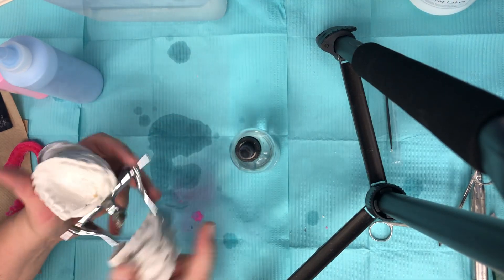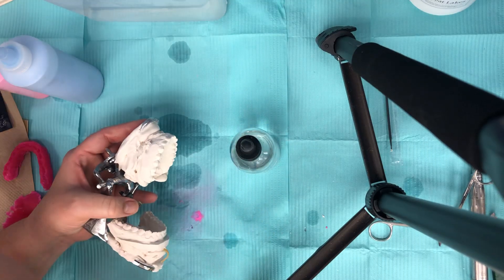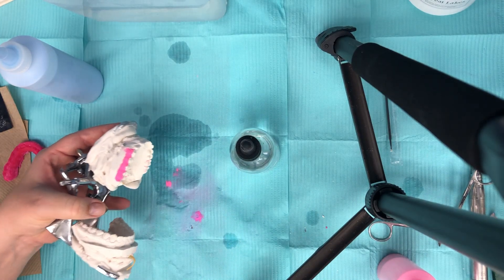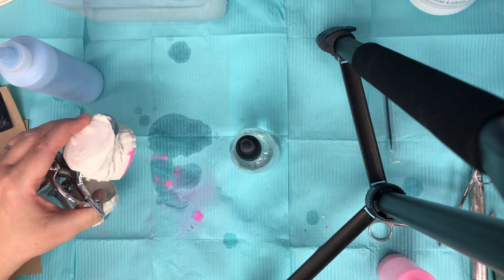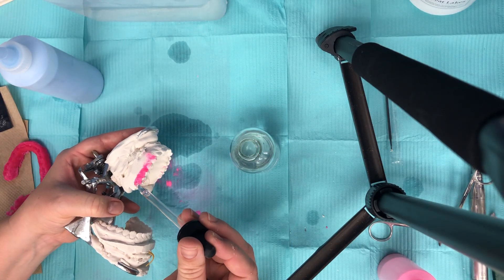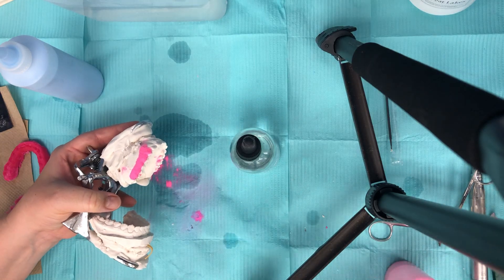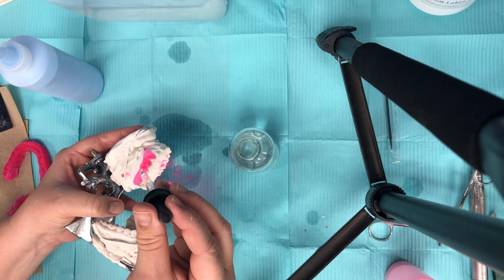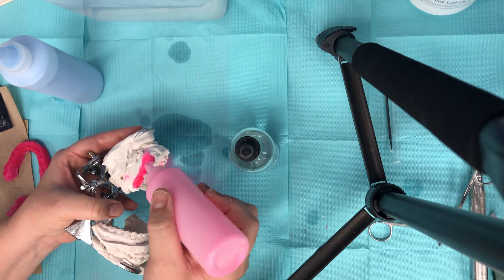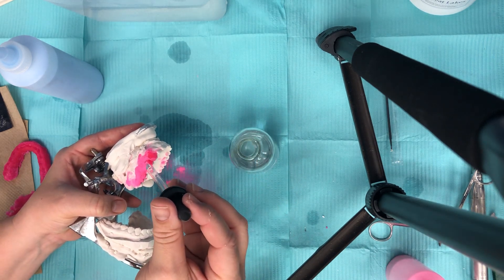Now we will go to the buccal on the upper right side and start with pink. We're gonna want to keep this parallel wherever you're working because if you tilt it then you're going to be wasting the polymer. So making sure we hold the model and keep it parallel. There are a couple of different methods of doing this, but since you guys are beginners to working with acrylic and the salt and pepper technique, we're just gonna do it this way and then add in some detailed things later on.